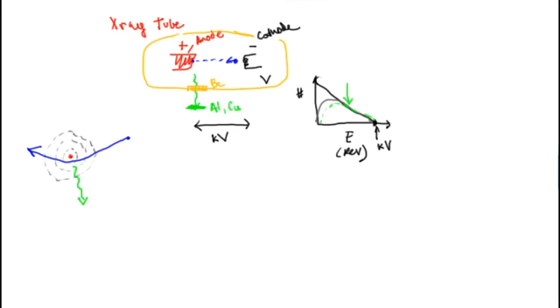Okay, now let's look at the kV, the potential between the anode and the cathode, because that's going to have a strong dependence on the spectrum. I've written this as kV, but usually it's written as kVp. Let me explain what that means.